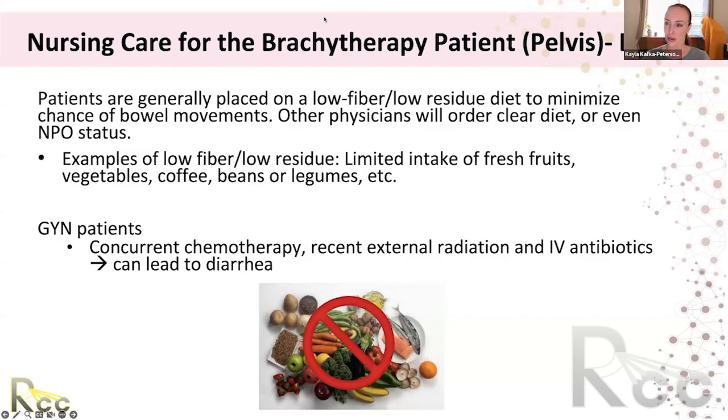Some physicians do not want their patients moved at all, but once they're in the hospital for 3 days, there will be a bad bed sore occurring if we don't, especially on larger patients, which a lot of these patients have some body mass to them. And so for those patients, we anchor these implants with sutures, and the needles themselves are very fixed. We do a scan every morning to make sure they haven't moved. And if they have, we can adjust back to make sure we're right on target.